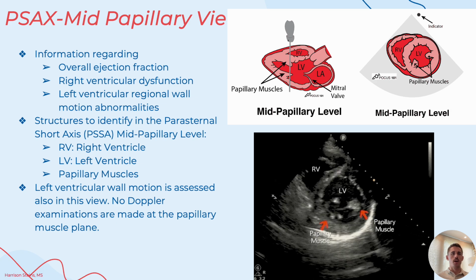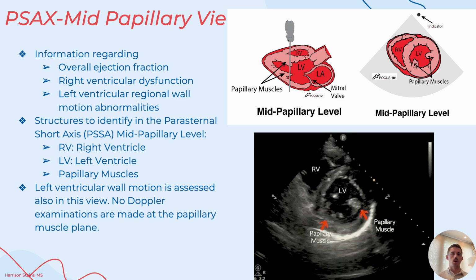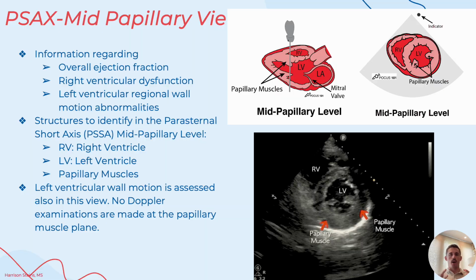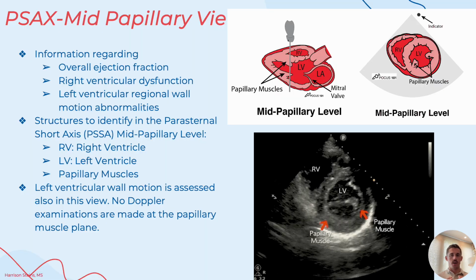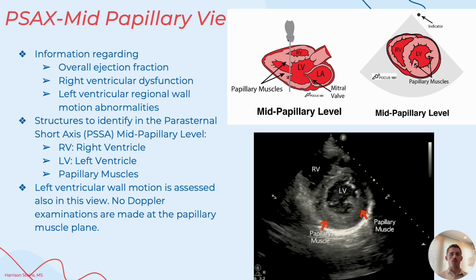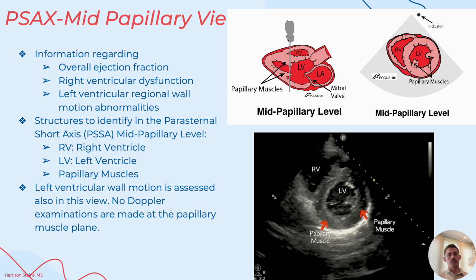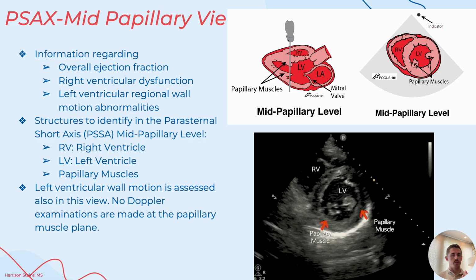So starting with the mid-papillary view, we're trying to get information regarding the overall ejection fraction, how well are the valves coming together and opening back up. Looking at the right ventricle for any sort of dysfunction. Is that right ventricle bowing into the left ventricle at the interventricular septum?